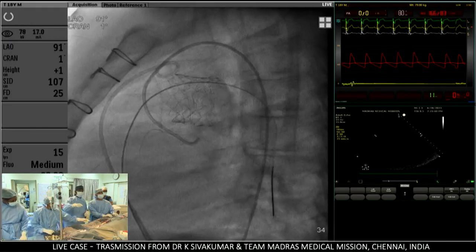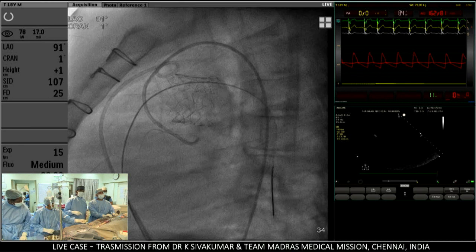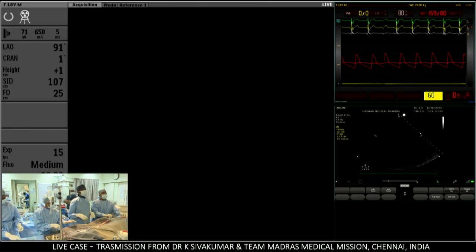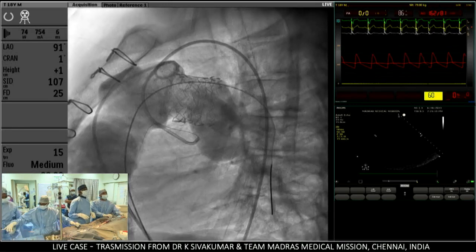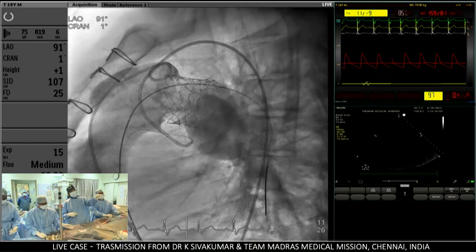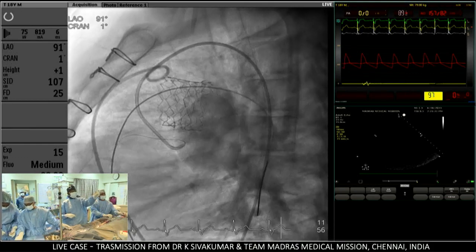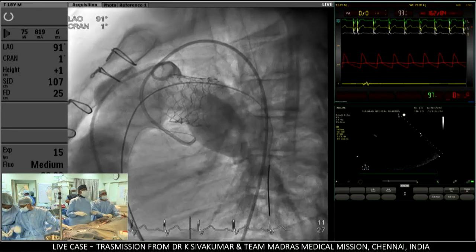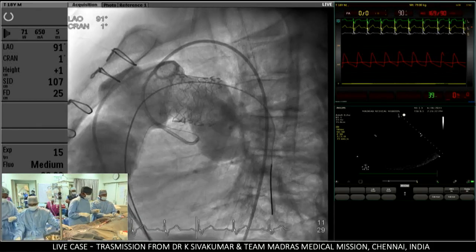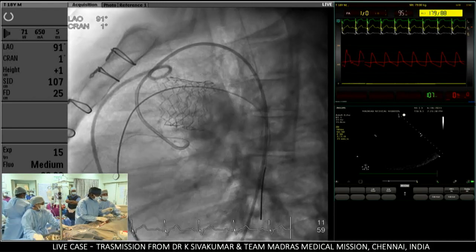Can we inject now? Inject. I think 30 ml. Myval, what size? They go up to 32, but the length, I think, is shorter than Sapien, but we'll check. Okay, now in this you can measure. You can make the measurements based on the catheter or something. I think the approximation is quite appropriate. I will make a coronary angiogram now.